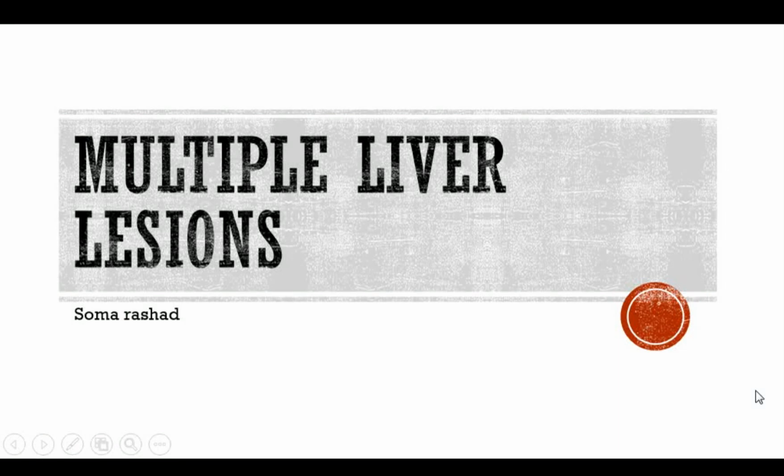So today we continue with our series on abdominal imaging with a very interesting presentation done by Dr. Soma about multiple liver lesions. Last week we talked about solitary liver lesions. So in order to have a full coverage, we will do multiple liver lesions at the same time.